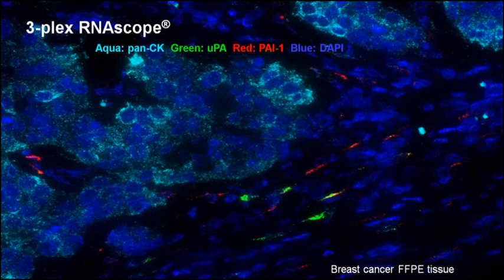Now, here's the answer to this unsolved miracle. It's actually not the breast cancer cells that are stained here in light blue with a pancytokeratin staining. It's stroma cells in the vicinity of the tumor, and it's not the tumor itself. If you move away from the tumor, there is no more staining of plasminogen activator. But that is the solution.